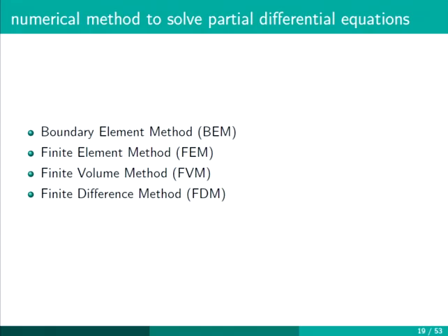As to the methods that we can employ to solve, in general, partial differential equations, in our case the EEG and MEG forward problem, this is a list. We can choose between boundary element method, BEM, finite element method, finite volume method, finite difference method.